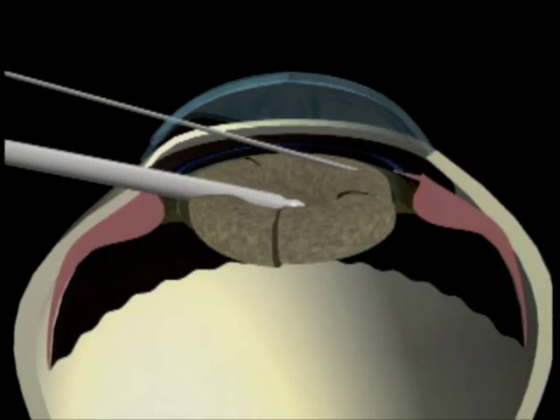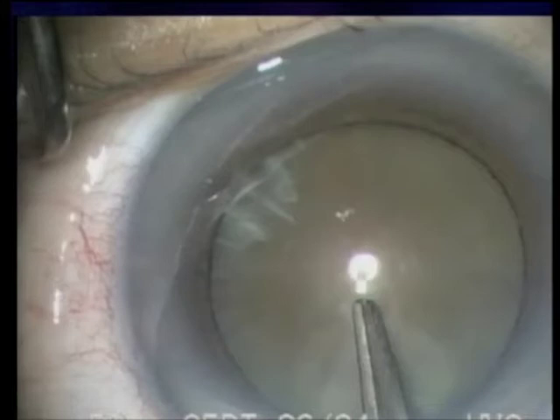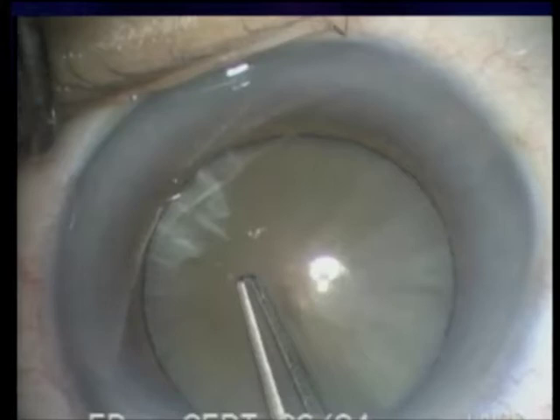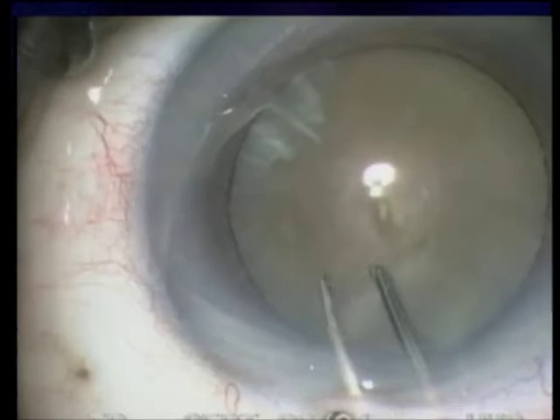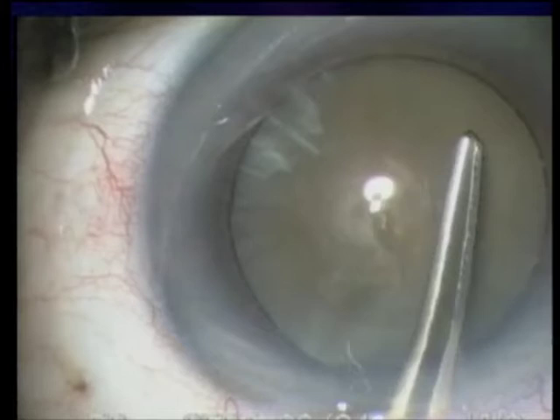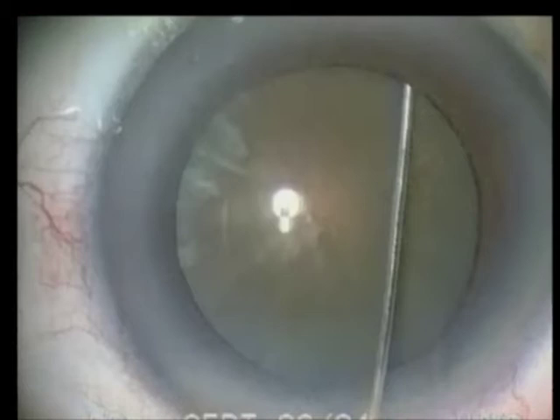Then the nuclear rim is fractured by the chop technique and the segments are brought into the center for emulsification. I begin the capsulorhexis by placing the forceps centrally to create a puncture in the anterior capsule. This reduces stress in the zonules and improves the ability to attain the desired direction of the capsulorhexis. I then grasp the advancing tear and continue in a counterclockwise direction. Stabilizing the eye with the forceps on the sclera is necessary when doing the surgery under topical anesthesia, which I do in 99% of cataract surgeries.